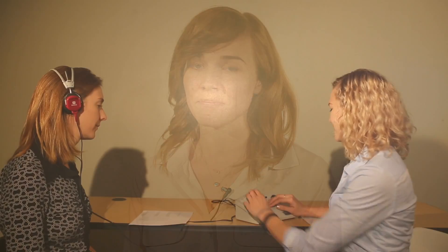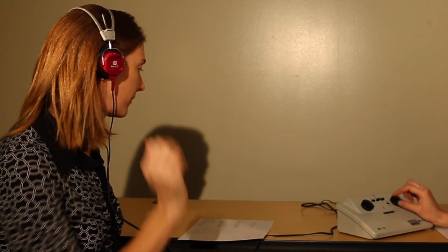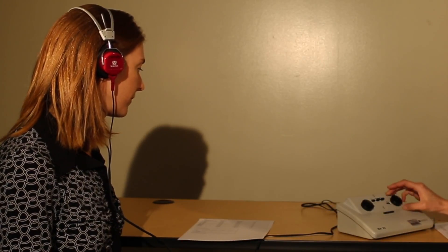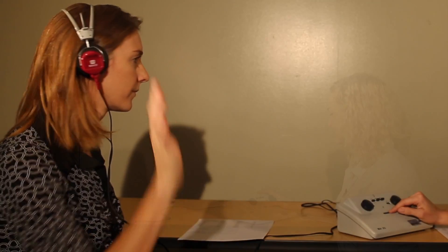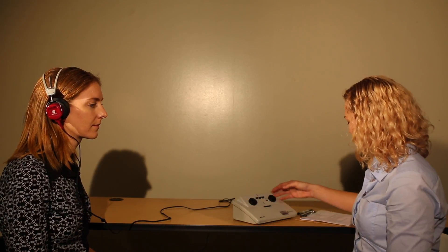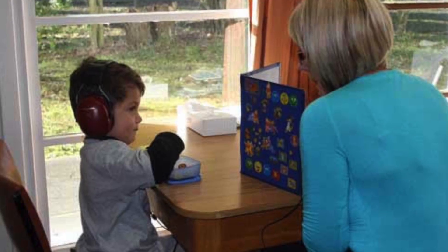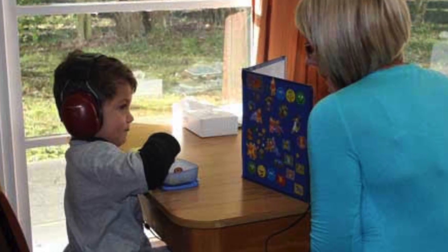Here are some things to keep in mind during your testing. Make sure that the patient cannot see or guess when you are pushing the button — their response should only be to the sound they hear from the audiometer. You can minimize this common mistake by covering the button with your spare hand or turning the audiometer away from the patient. You may even wish to have a shade or similar object blocking the patient's view of the audiometer. Additionally, be aware of visual, auditory, or patterning clues.